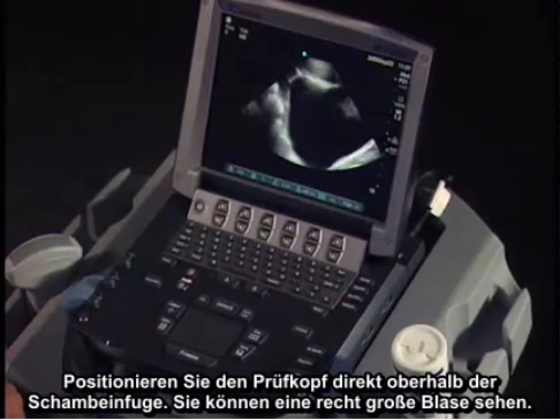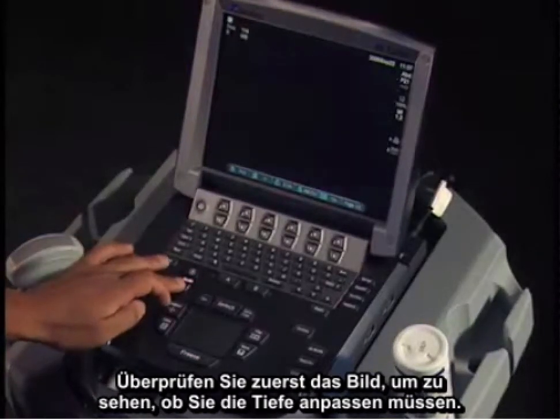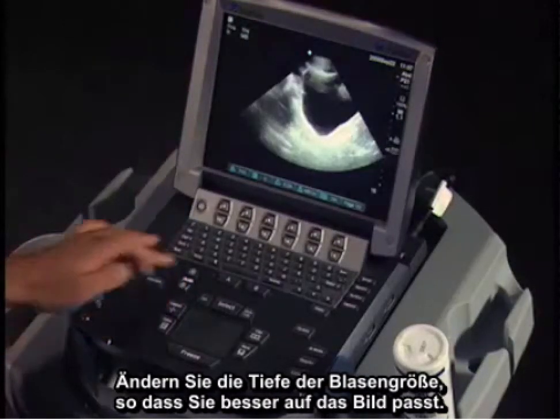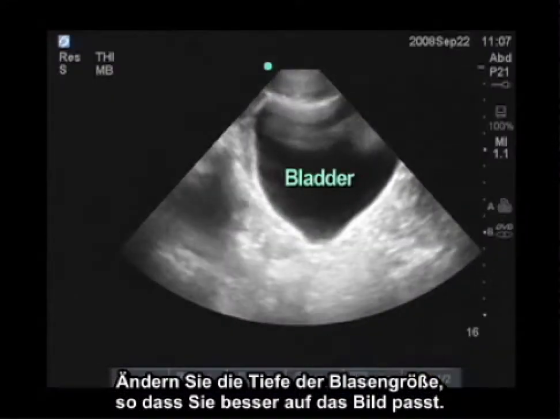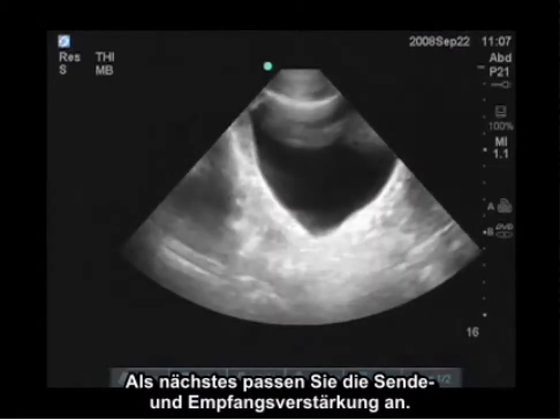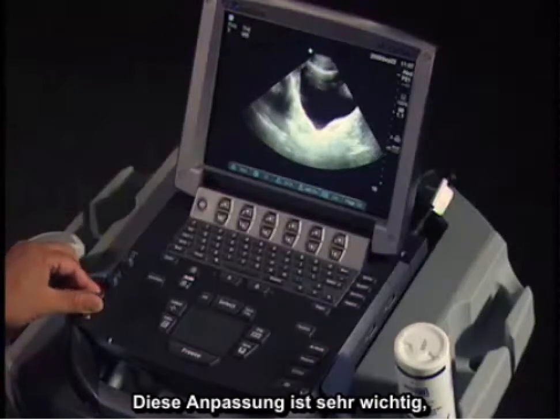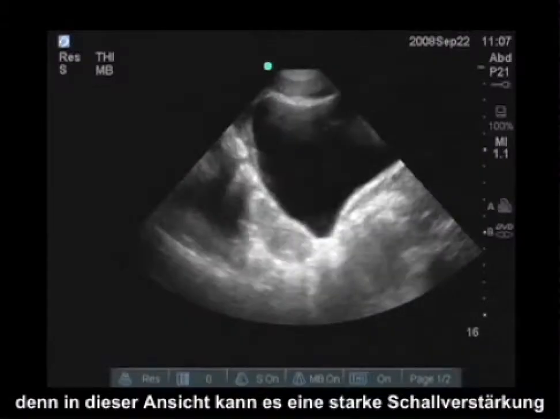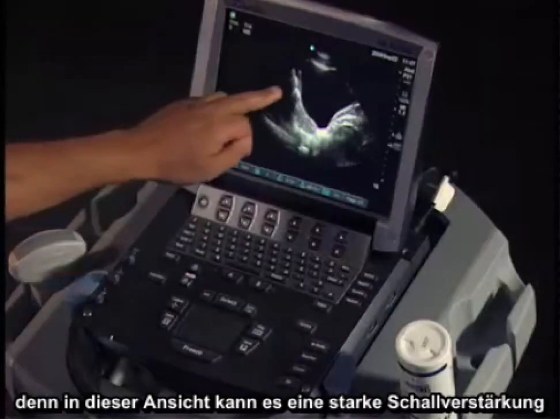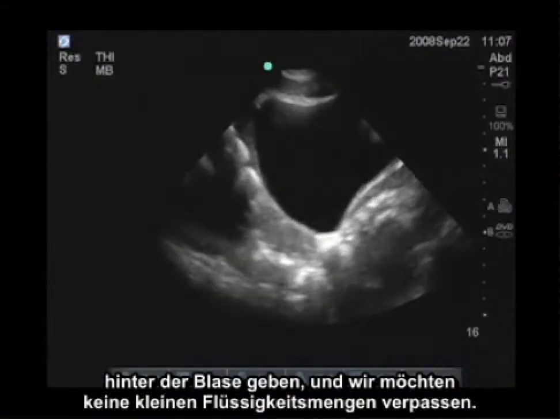We can see a pretty large bladder here. First thing I'll take a look at is that we need to adjust our depth. I'm changing the depth here to make the bladder fit better within the image. The next thing I notice is that I need to adjust the gain. This is an important knob to adjust because in this view particularly, you can have a lot of acoustic enhancement posterior to the bladder, and we don't want to miss small amounts of fluid.